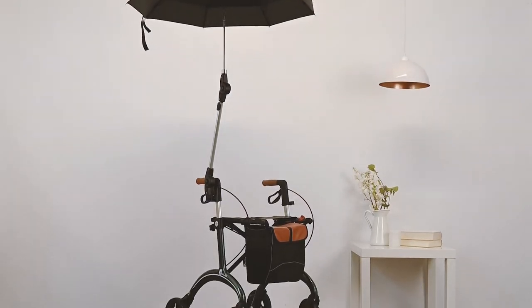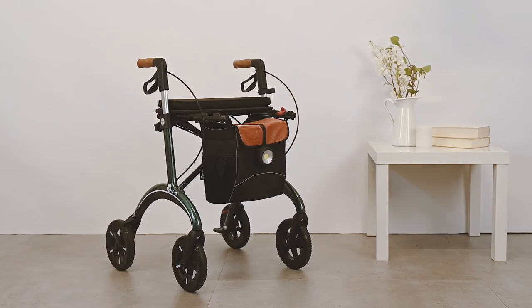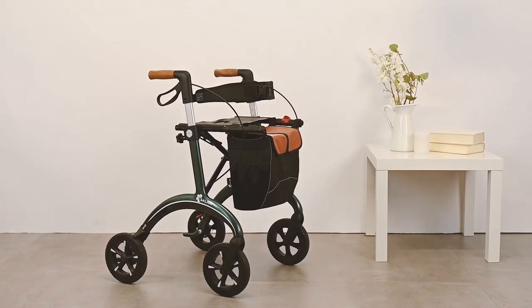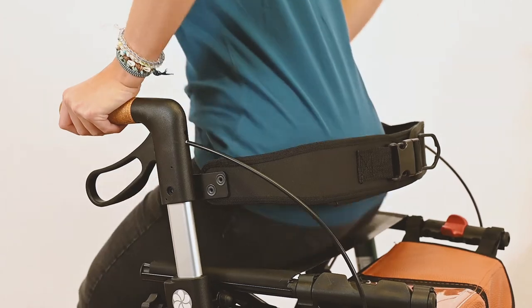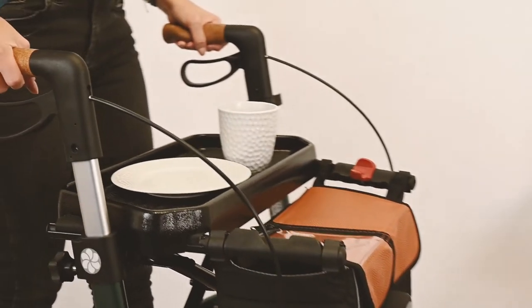Bad weather won't stop you with the umbrella — just put it up and you are ready to go. With the tight seat you always sit upright and comfortable, and the adjustable backrest prevents you from tipping over backwards.